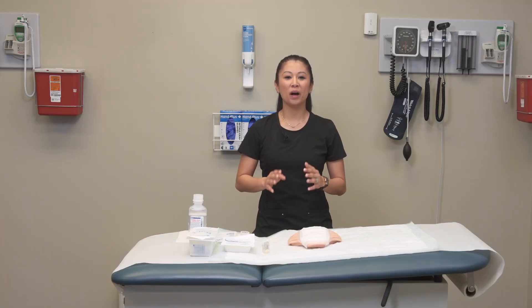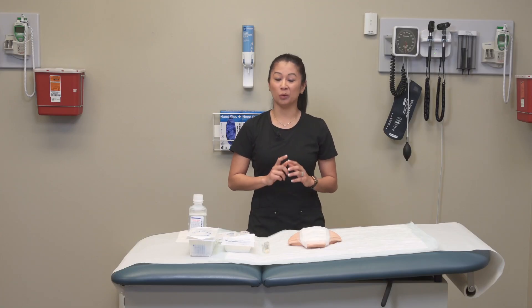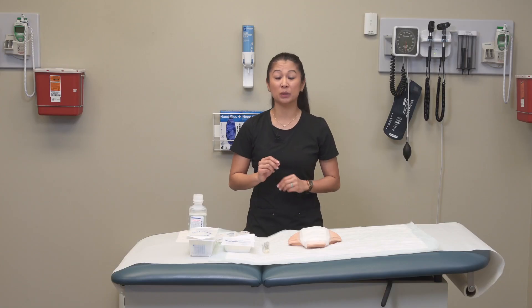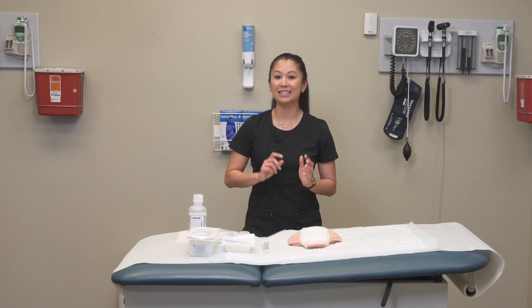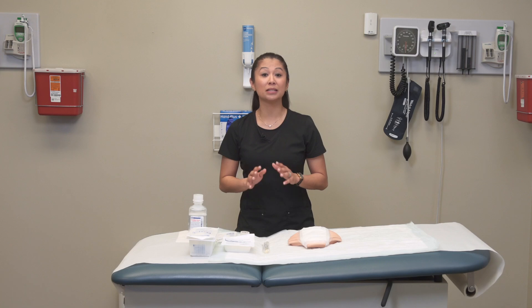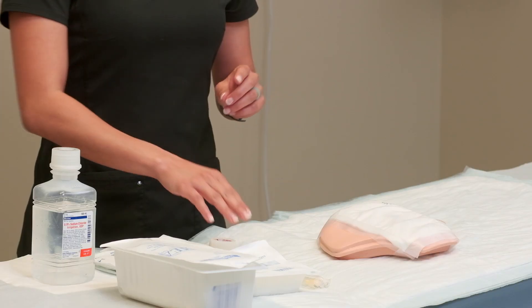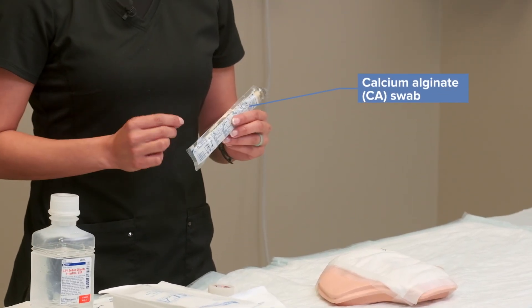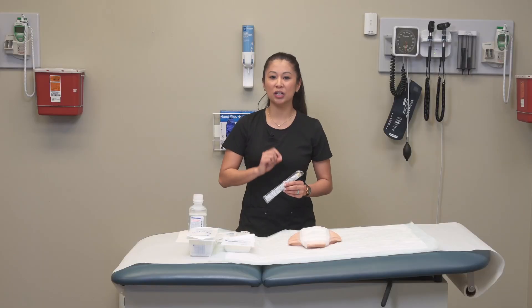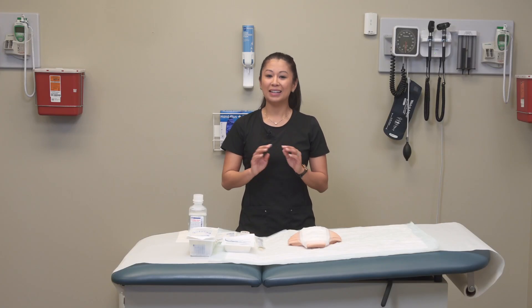Welcome to the live demo of how to culture a wound. We're taking a sample from inside the wound, usually because there are signs and symptoms of infection and we want to see what's potentially growing. For supplies, we're going to need the appropriate swab — typically a calcium alginate swab — but triple-check with your lab department to make sure you have the right one.